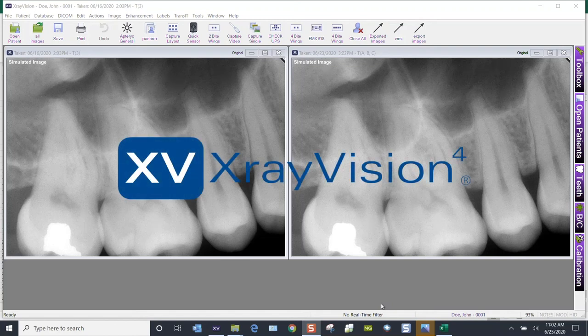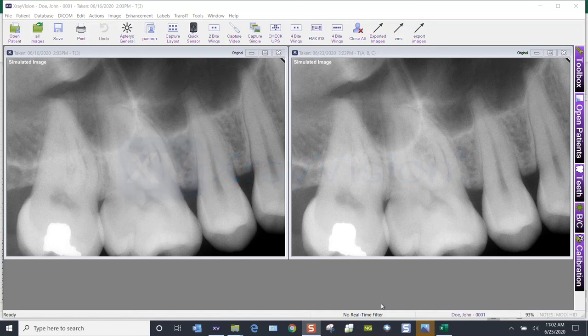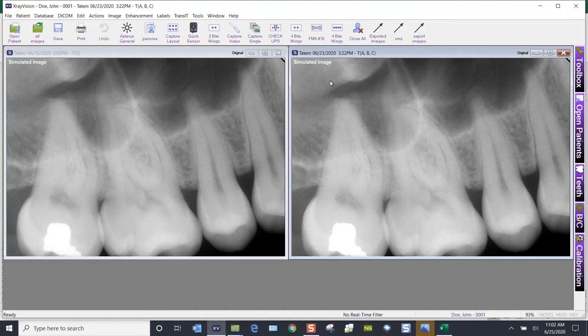This is a quick video on how to print multiple images inside X-Ray Vision. I've opened up two images, one from the 16th and one from the 23rd, maybe for an endodontic case.